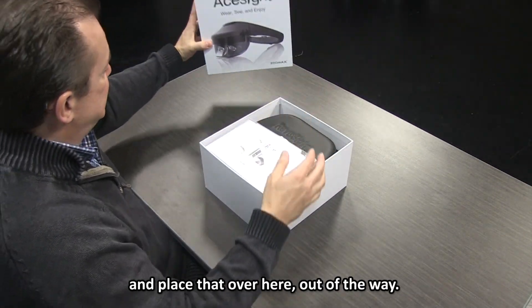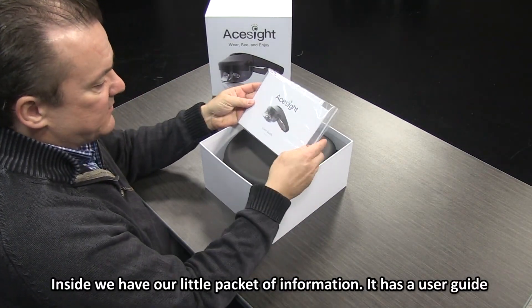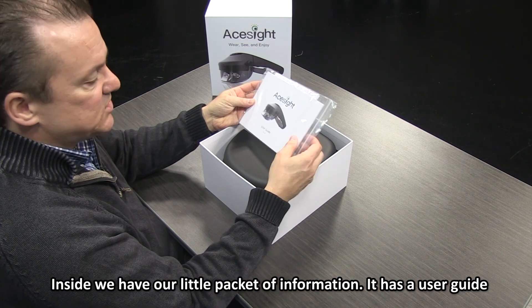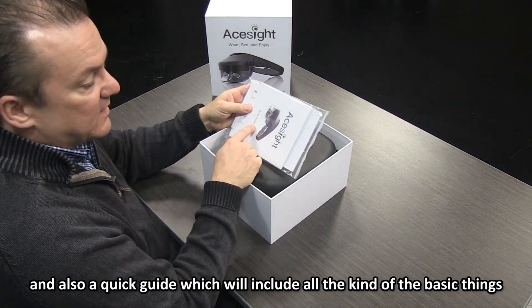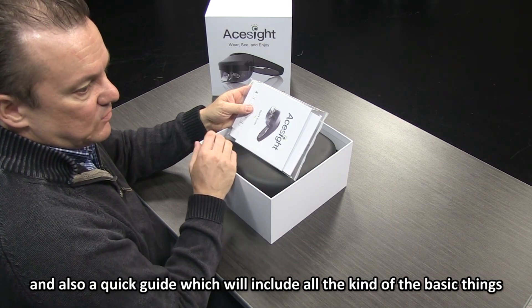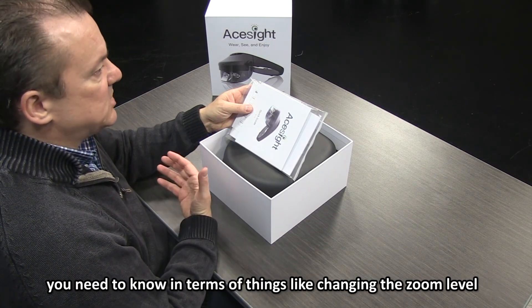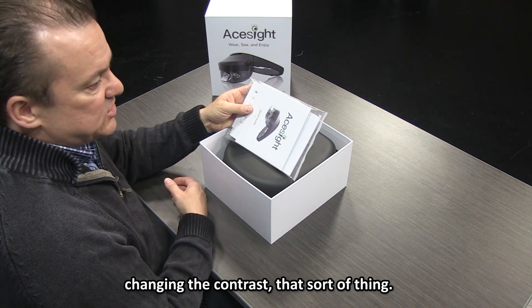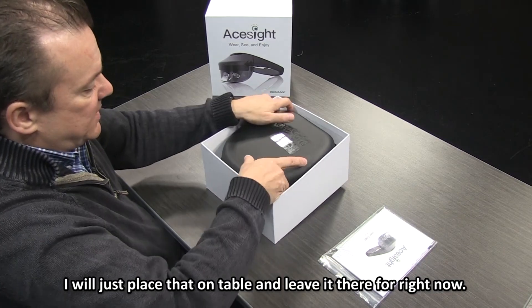I'm going to remove the lid and place that out of the way. Inside we have our little packet of information. It has a user guide, and there's also a quick guide which will include all of the basic things that you need to know — things like changing the zoom level, changing the contrast, that sort of thing. I'll just place that on the table for right now.